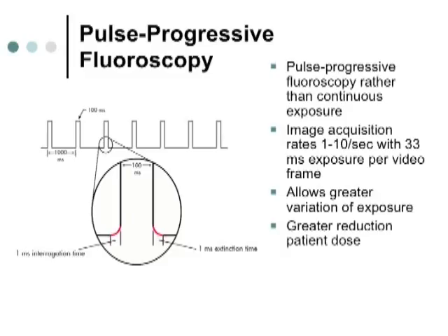In this type of fluoroscopy, you're only pulsating, and this is called duty time. We're only pulsating 1/10 of a second. So out of every 1,000 milliseconds, the exposure is 100 milliseconds of exposure to the patient with higher current. Higher current means more X-ray photons, more data, but 1/10 of the exposure to the patient. So you're lowering your exposure to the patient by this pulsating current.